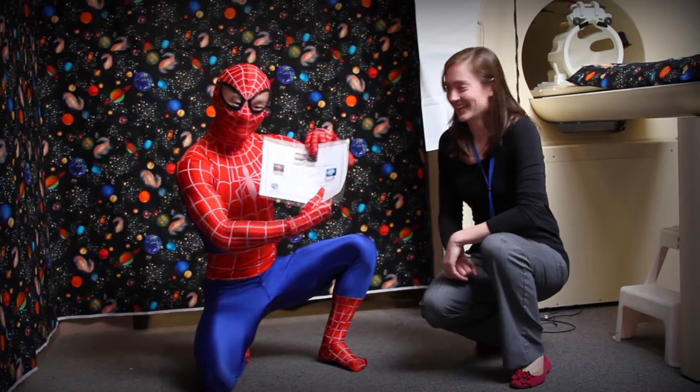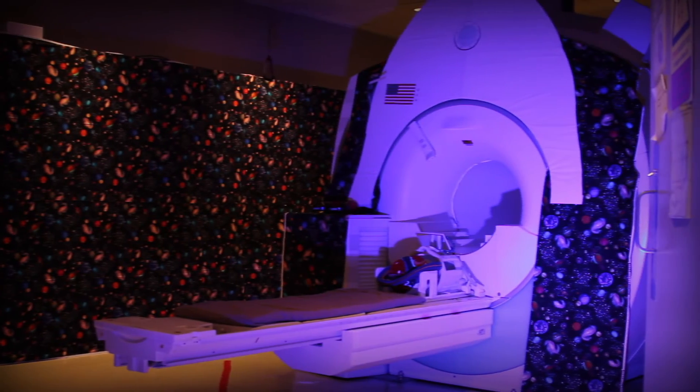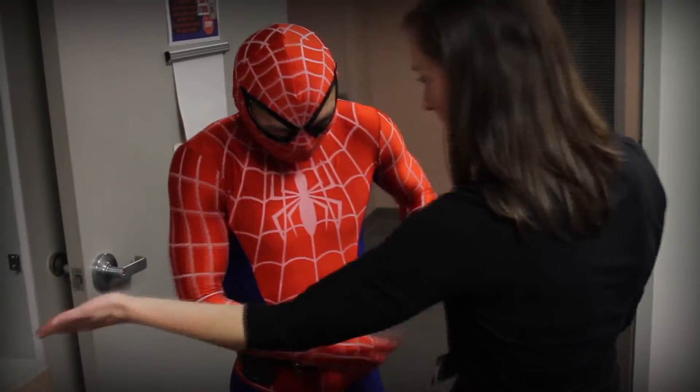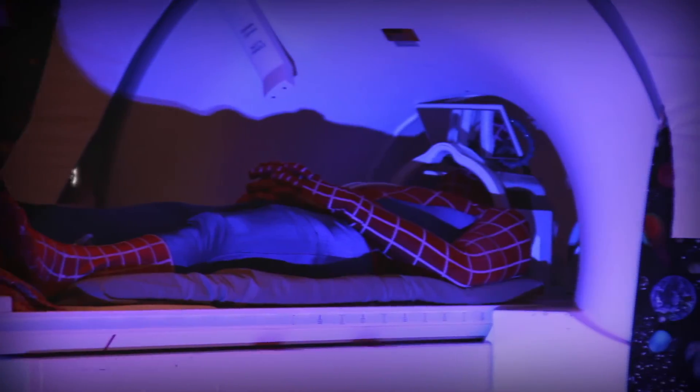Congratulations, astronaut! You are now ready for your real space mission. You will get to see the real MRI spaceship in a different room. Before you go into the new room, we will make sure you don't have anything in your pockets and are cleared for takeoff. You can now enter the room of the spaceship and prepare for your space mission. You still get to watch one of your favorite movies.